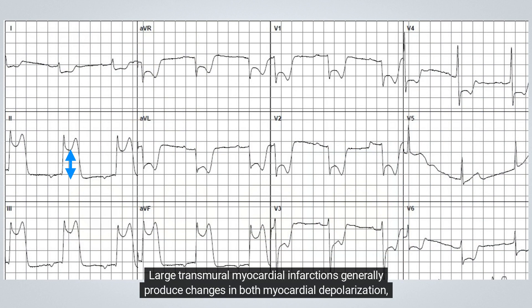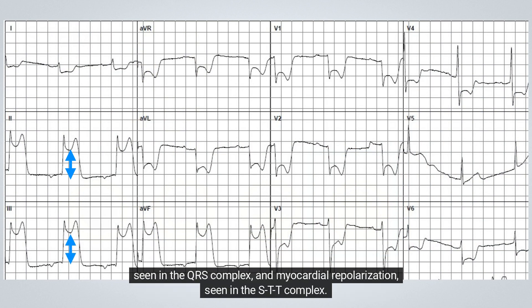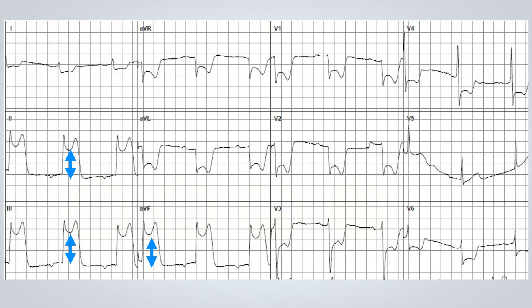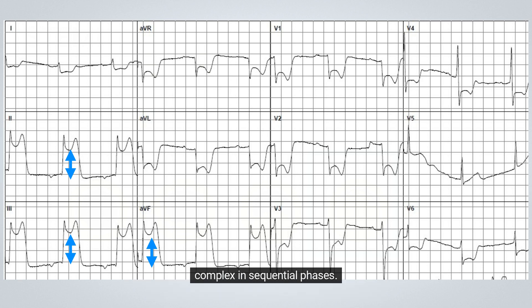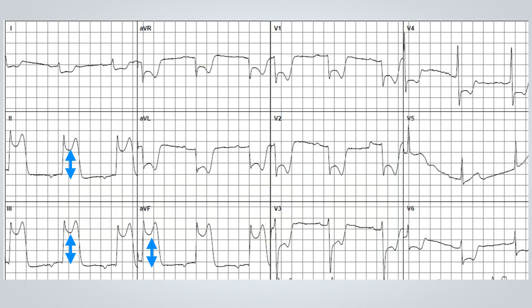Large transmural myocardial infarctions generally produce changes in both myocardial depolarization, seen in the QRS complex, and myocardial repolarization, seen in the STT complex. The earliest ECG changes observed with acute transmural ischemia or infarction typically occur in the STT complex and proceed through sequential phases.